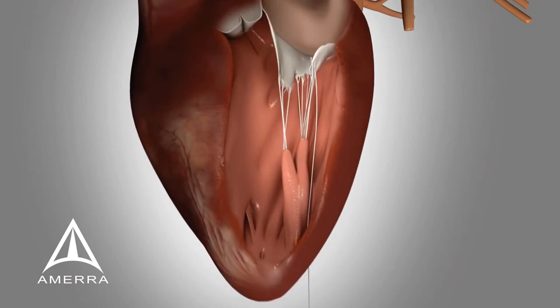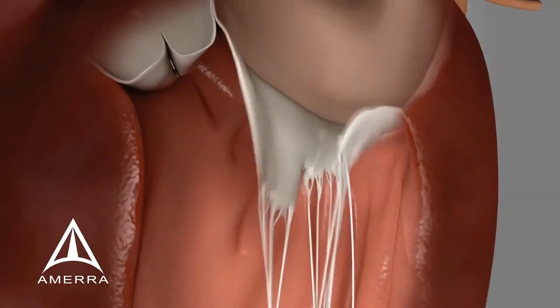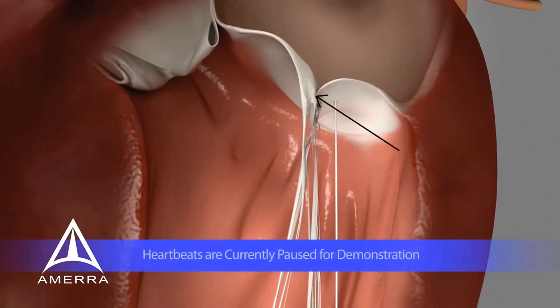Once the appropriate number of sutures have been inserted, the introducer is removed and the purse-string suture is tightened. All EPTFE neochords are progressively tensioned using transesophageal echocardiographic guidance. When the sutures are properly tensioned, it restores the natural area of coaptation between the posterior and anterior leaflets and eliminates MR.